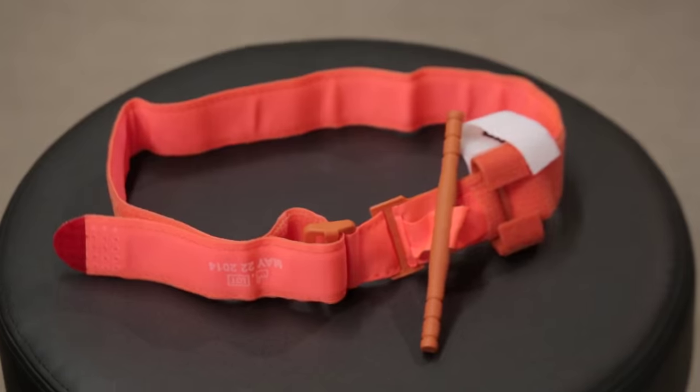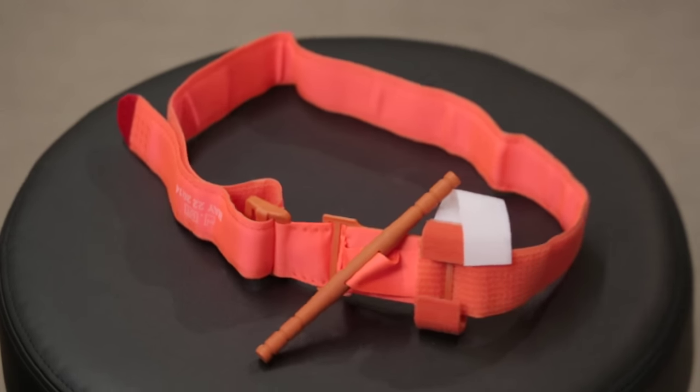We use tourniquets every day in operating rooms for orthopedic procedures for hours at a time. Our military experience and now our civilian experience would demonstrate to us that several hours of use of a tourniquet to control hemorrhage does not result in significant complications. Our experience with that is we've now got more than 100 patients treated by Gold Cross and Mayo One with the use of extremity tourniquets, and they carry with them a greater than 95% success rate in stopping bleeding.